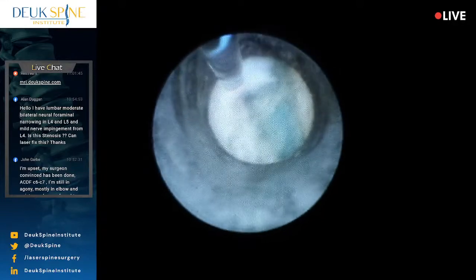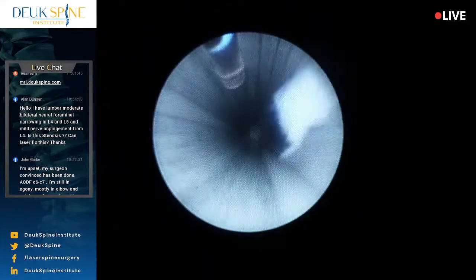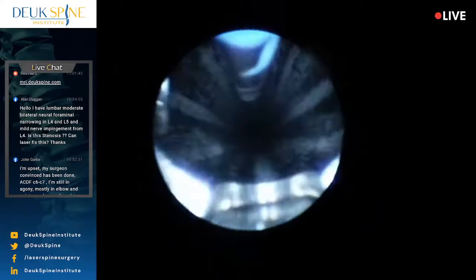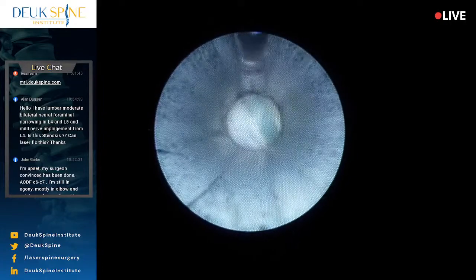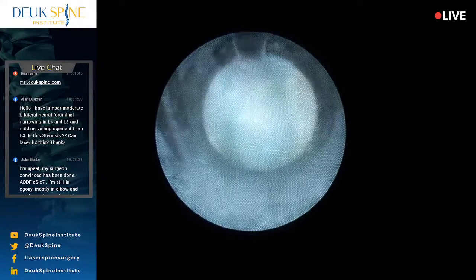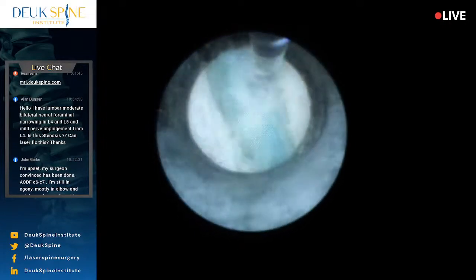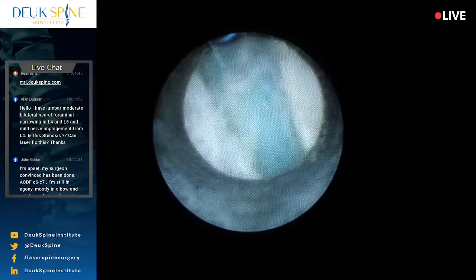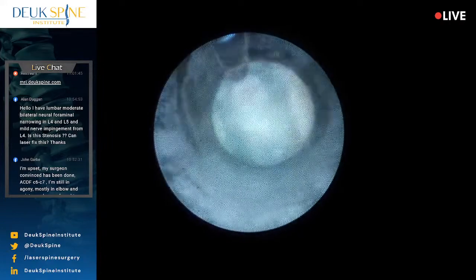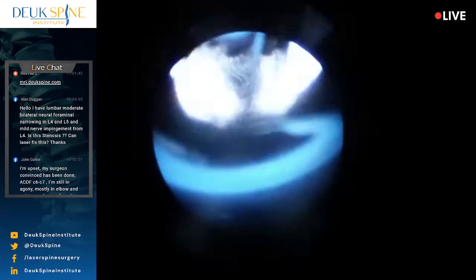And just take a peek. There's a little herniation, not much. It's about 0.5 millimeter there. Oh, by the way, the laser fiber itself, the glass tube at 12 o'clock, is 0.5 millimeter wide. So it gives you a reference point for everything else down there that you see. Again, want to make sure we don't do any damage to anything we're not supposed to damage. And basically, that's it. It's clean. So we're done. Lights on, please.